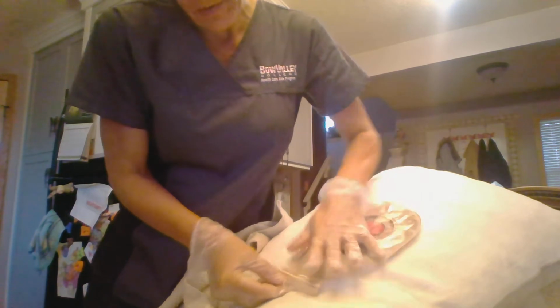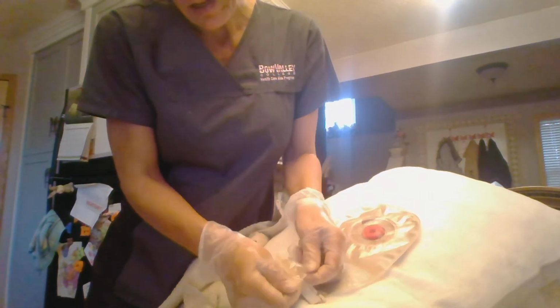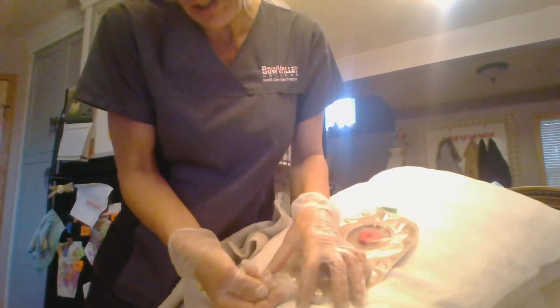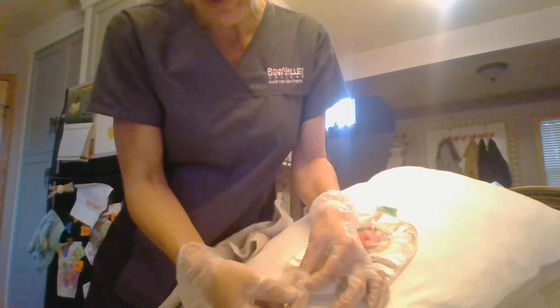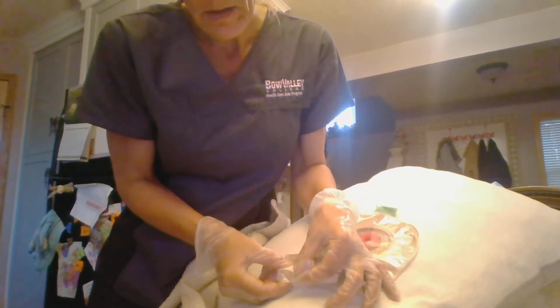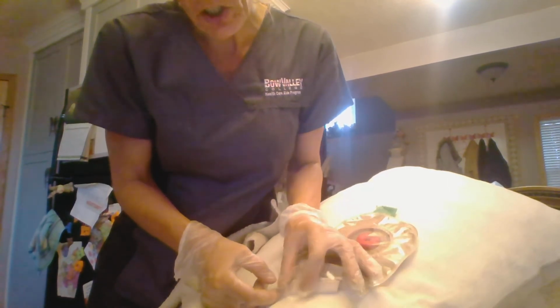If this bag needed to be drained, you could actually pull this plastic over. It should be at least a couple inches that you would be able to fold this over and put your fingers behind it, which would almost form a tunnel or a funnel-like cupping. It's actually called cupping.